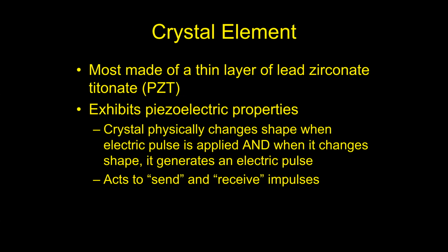Now, what is that crystal actually made out of? The white part in the middle of the Oreo cookie. That crystal in all of these machines is made out of a ceramic called lead zirconate titanate. That ceramic material has what's called piezoelectric properties. You might remember that word from undergrad physics.